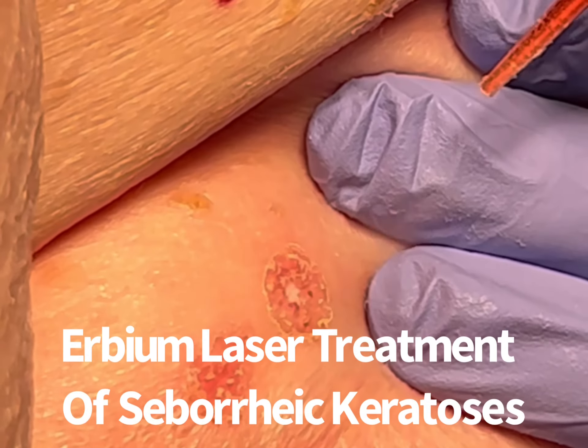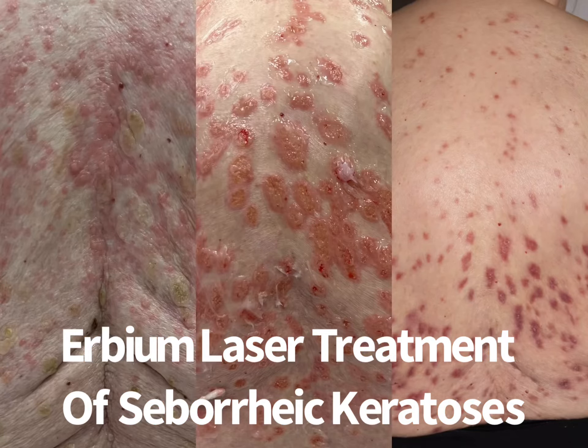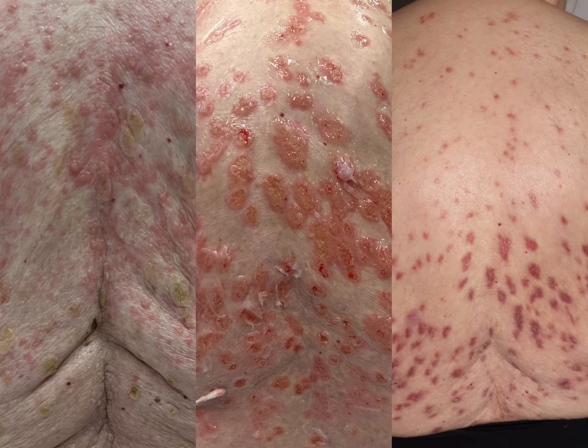If performed precisely, hundreds of lesions can be removed with little or no scarring. It takes six months or more for the redness to fade following treatment. This photo shows extensive lesions preoperatively on the left, immediately following treatment in the center photo, and six weeks following treatment on the right.